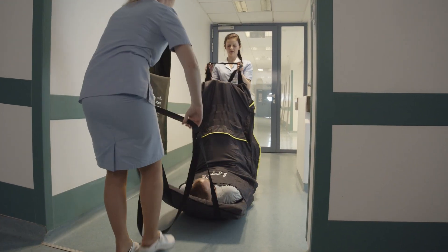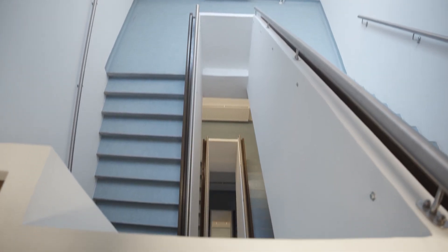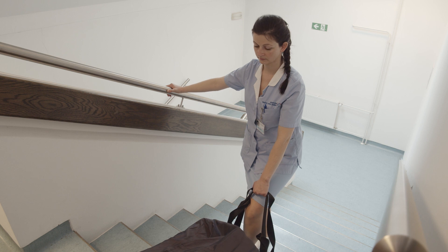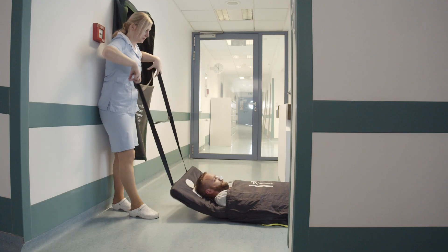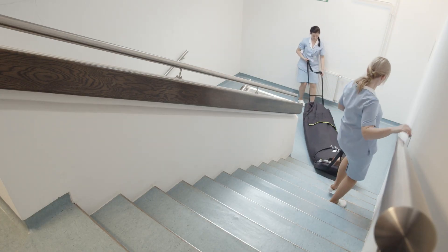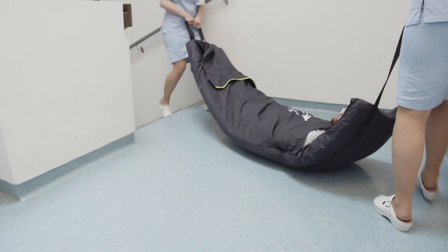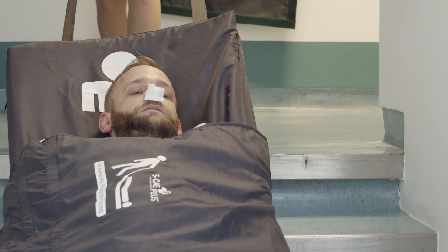You can easily turn a patient in a confined space by lifting the patient's legs. If you are on a higher floor, the evacuation will be performed down the stairs. Stand a few steps lower and pull the patient towards you with his or her feet forward. Make sure the other person holds securely the belts at the head. The assisting person is responsible for the necessary braking and cornering when bringing the patient down the stairs using the belt on the evacuation mat at the patient's head.